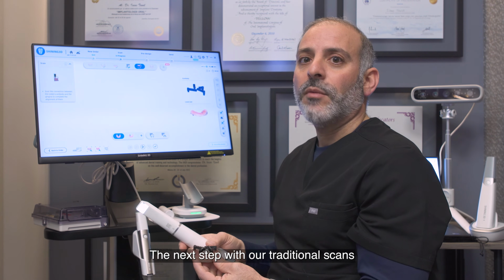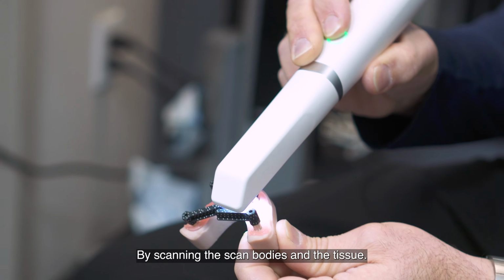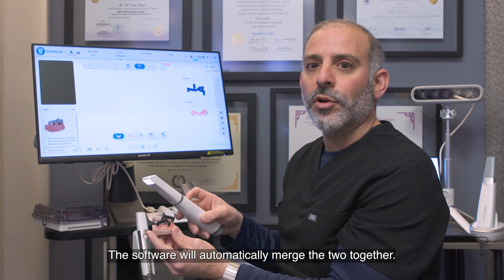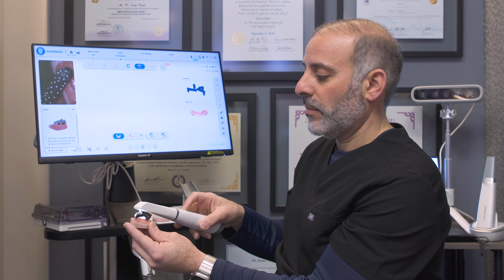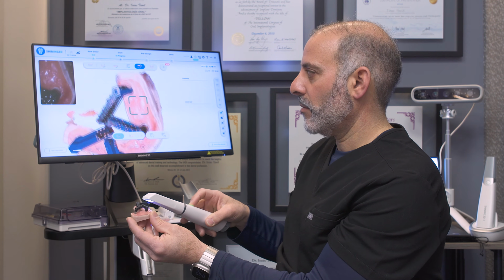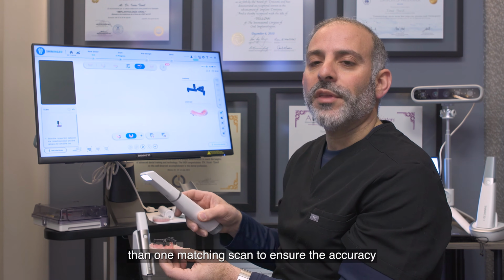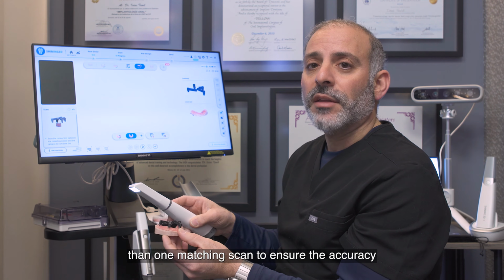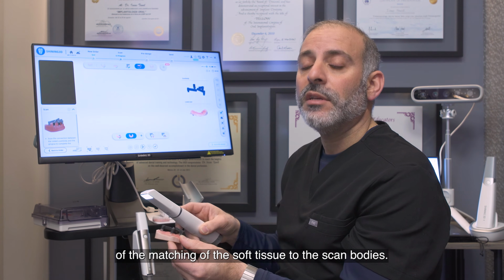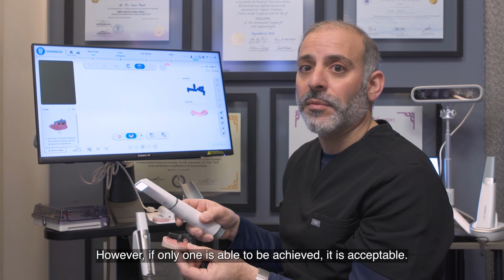The next step with our traditional scans is to match it to the existing soft tissue. By scanning the scan bodies and the tissue, the software will automatically merge the two together. It is suggested to take more than one matching scan to ensure the accuracy of the matching of the soft tissue to the scan bodies. However, if only one is able to be achieved, it is acceptable.